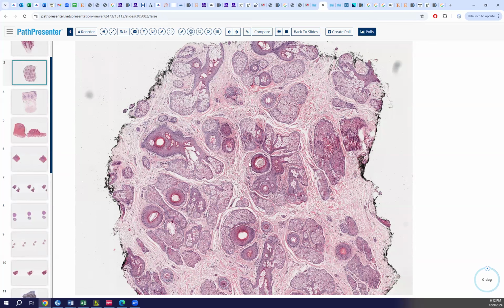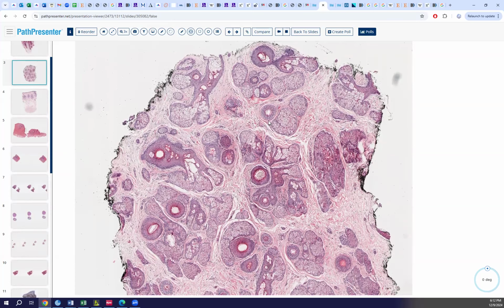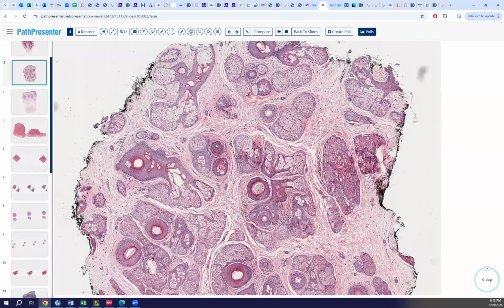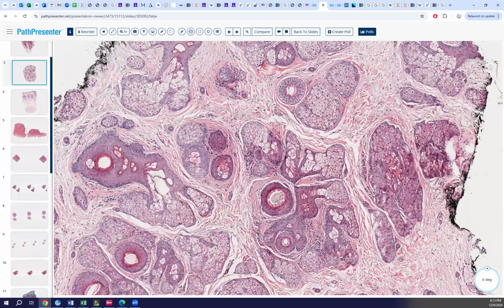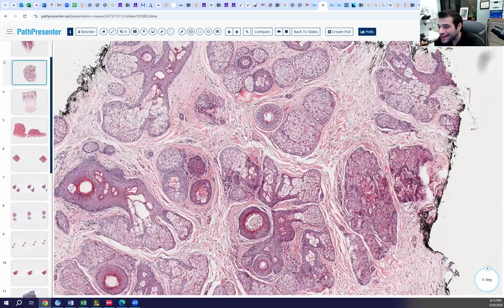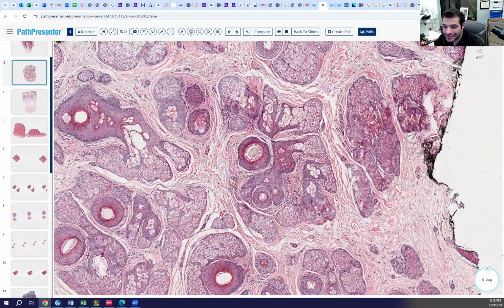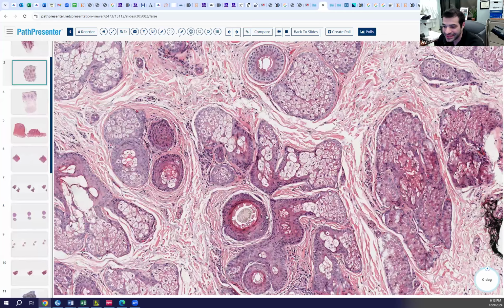Okay, tell me about the number of the hairs. Looks fine. Tell me about the size of the hairs. They look pretty thick, healthy. Like these are normal size hairs?